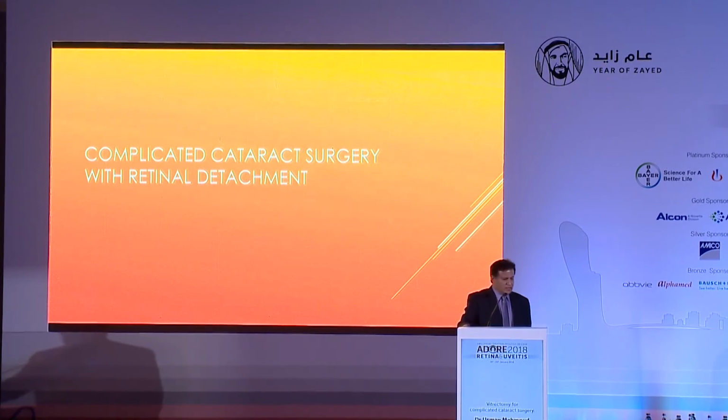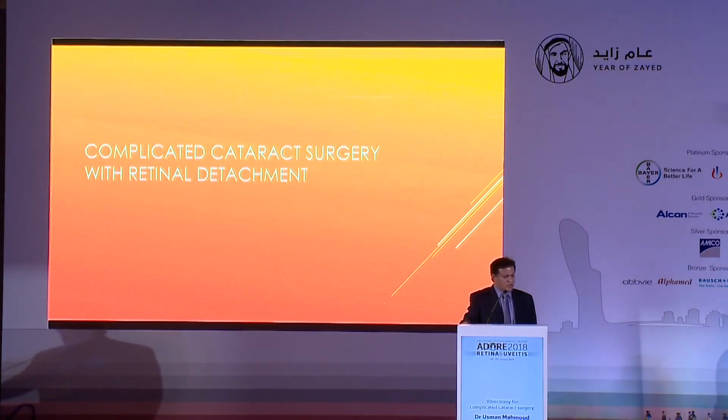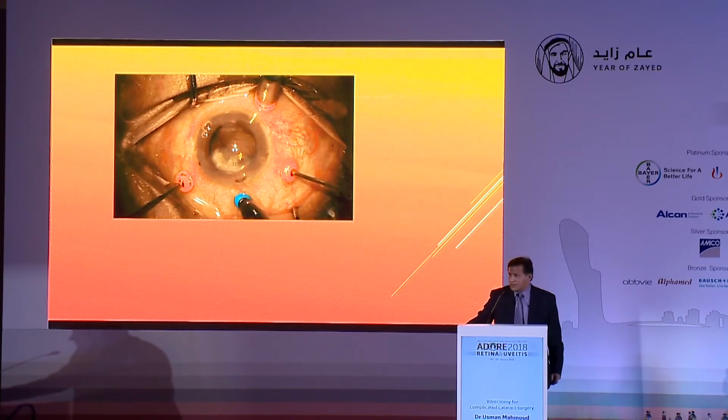Moving on to the next complicated situation, which I've recently come across, where a cataract surgery was performed elsewhere with a posterior capsular tear and then resulted in detachment the next day. Can I have the videos, please?